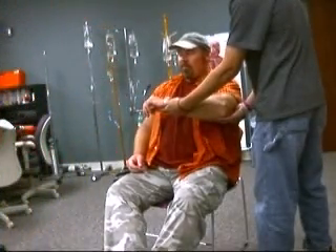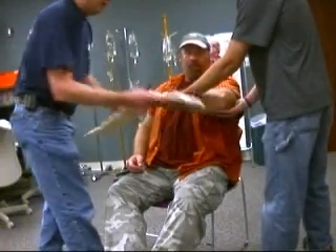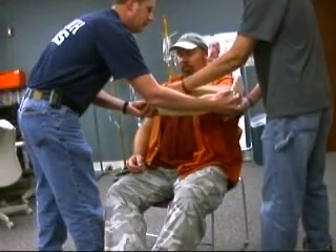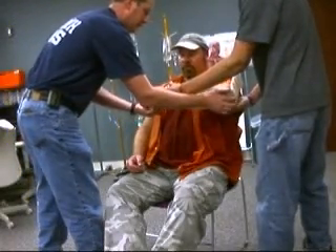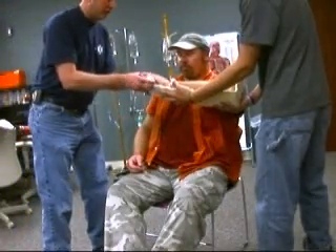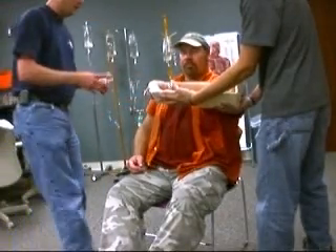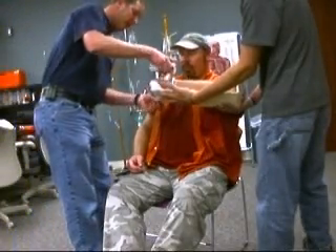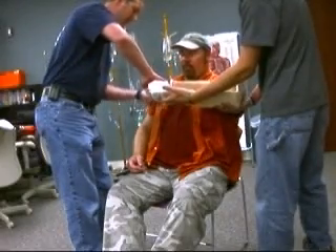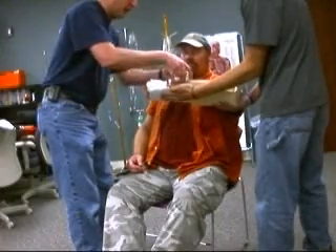I'm going to select an appropriate splint. I'm going to measure that splint and apply it to the arm. I'm going to put a roll of gauze in the hand so that it's in the position of function. I'm then going to secure the arm to the splint, making sure it's not so tight that it cuts off circulation, but tight enough to immobilize the fracture.